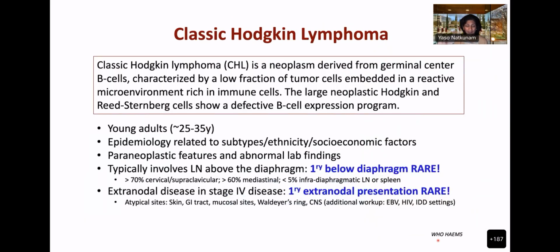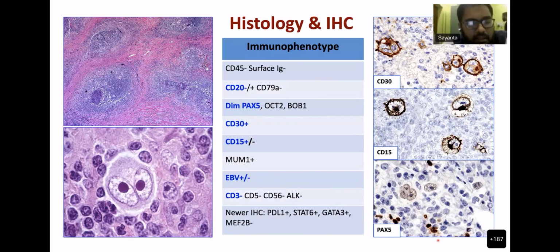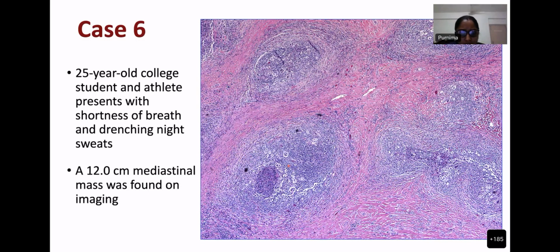Ma'am, what is there in the center of the nodule, that blue thing? Apoptotic bodies, these are dense. The lacunar cells are there, and in the center, the blue portion. I think there are apoptotic bodies, which is what I think this is, but also variation in how you cut and stain. There's a few here too, right?